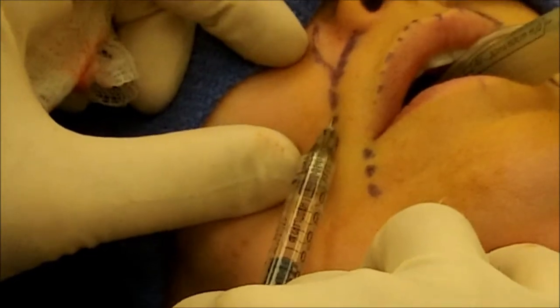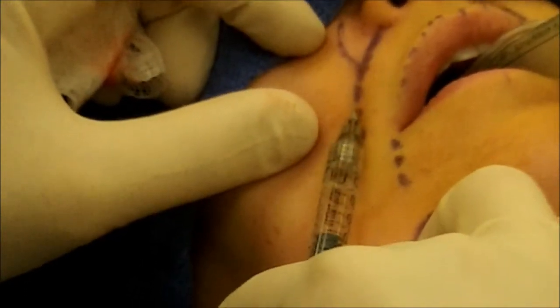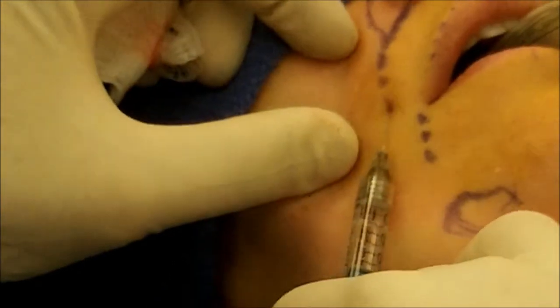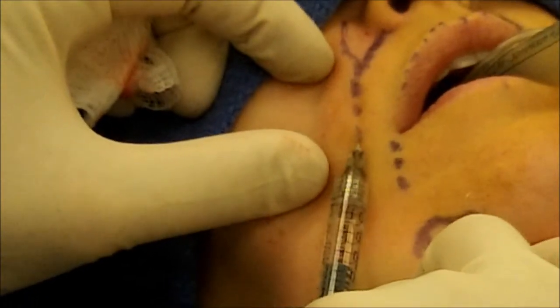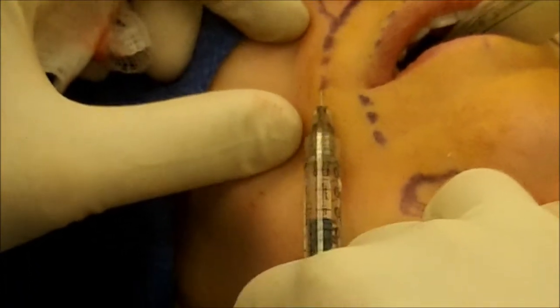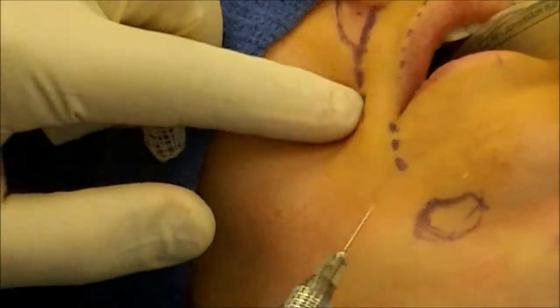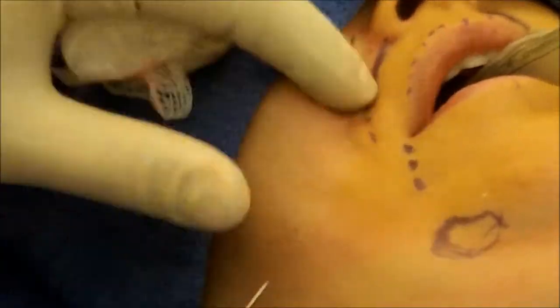I give it a little bit more fullness in there and go all the way down, just deep to the skin. I don't want it to be too superficial. Going right underneath and putting little tiny bits of Juvederm all the way along the fold, just underneath the skin. Using the fanning technique, putting a little bit in and massaging as I go to give a nice fullness to the fold.